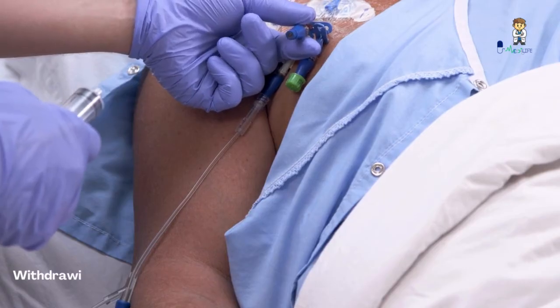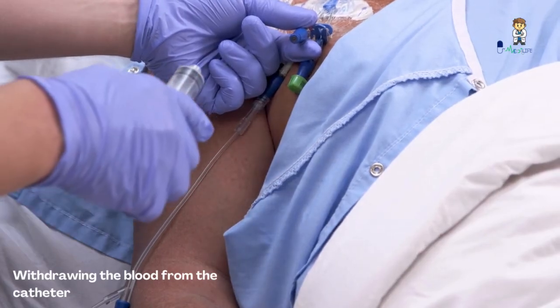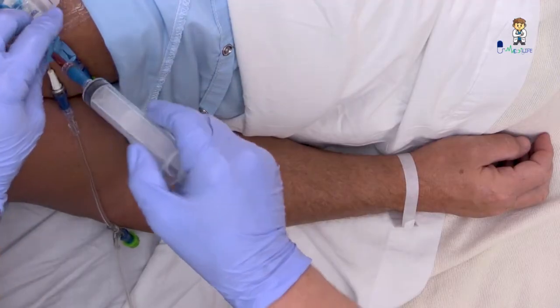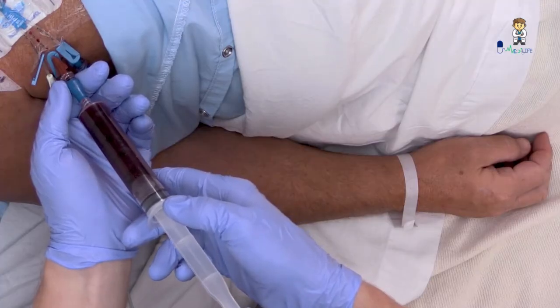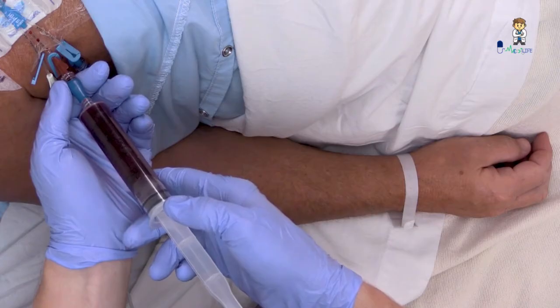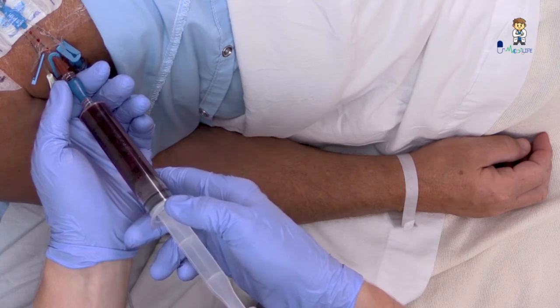If you're also drawing blood for other laboratory tests, draw blood for culture before drawing the sample for other tests. Maintaining sterility of the syringe tip, connect the empty syringe to the catheter, release the clamp, and withdraw a quantity of blood sufficient for isolating organisms — 20 to 30 milliliters. Follow the manufacturer's recommendations for blood sample volume per collection bottle. Don't discard the first-drawn blood; this is the sample you'll inject into the culture bottle.